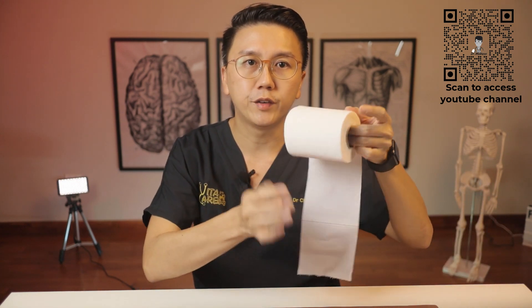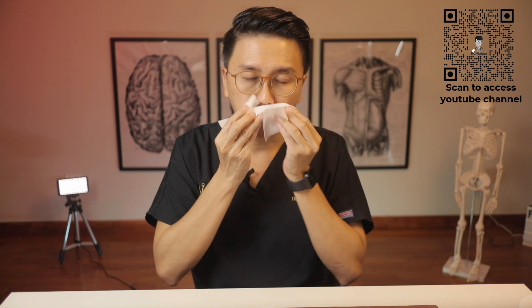Secondly, clear your nose first. Then tear open the package containing the swab stick.